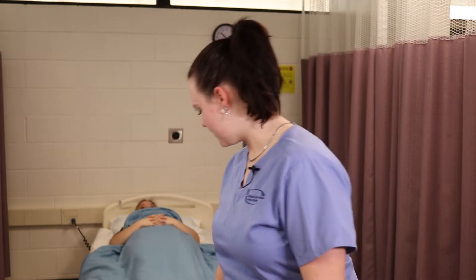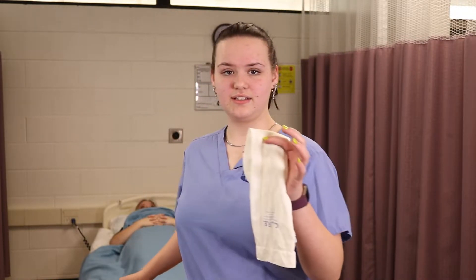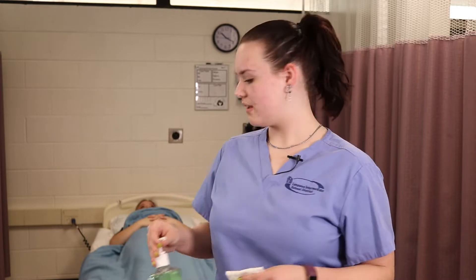My name is Olivia McClellan and I'm going to be applying an anti-embolism stocking to the right or left side, depending upon the scenario. One of the most important things is to make sure that when you apply the stocking, you leave the patient's stocking wrinkle-free and very smooth. I have two supplies: the stocking and some hand sanitizer. My patient is Brenna Davis and I'm going to go apply her stocking.